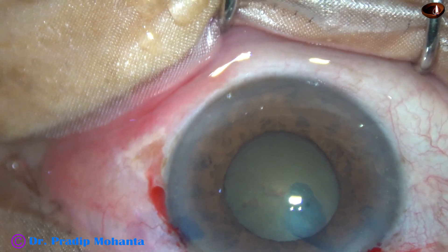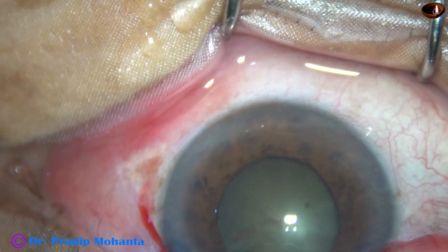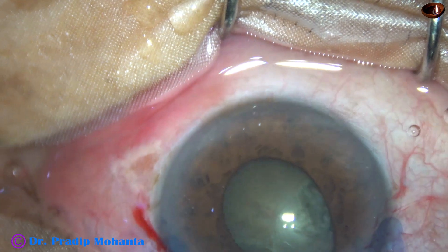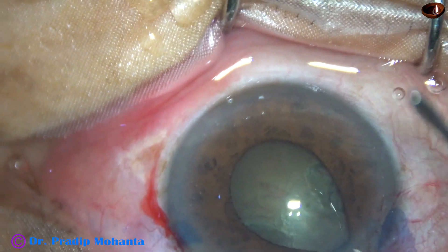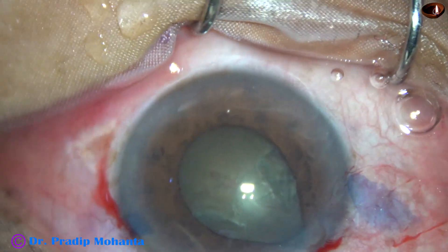And it is done. Now as I do hydrodissection, the iris tends to prolapse through the side port and through the main wound. And as I inject visco, the iris tends to come out.